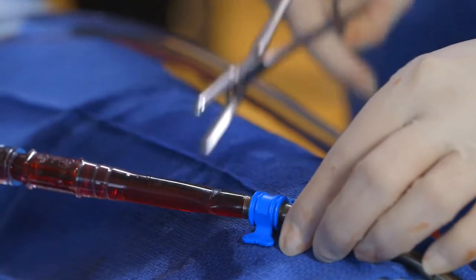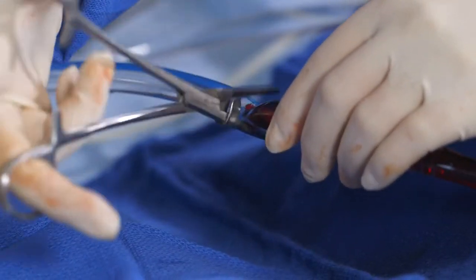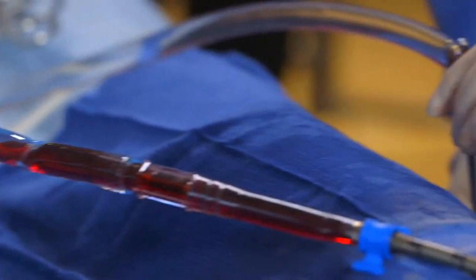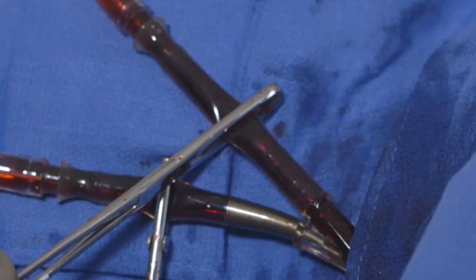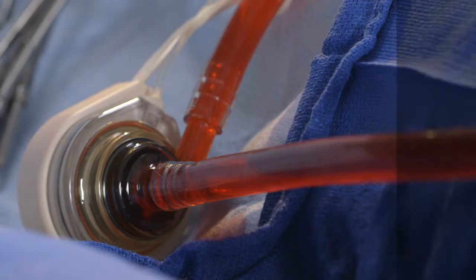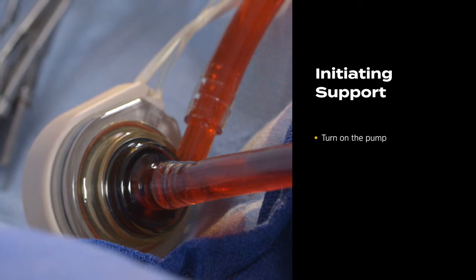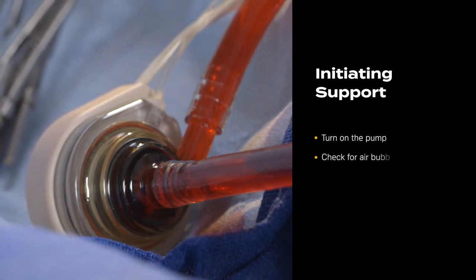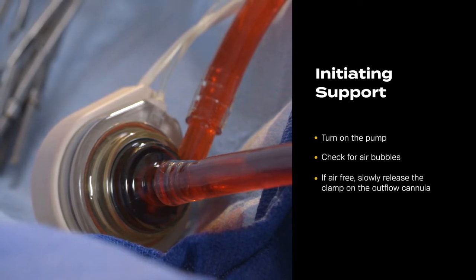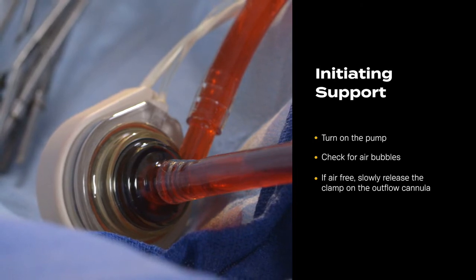Release the clamps on the inflow cannula. Release the clamps on the pump inflow tubing, marked with the blue stripe, and on the pump outflow tubing, marked with the red stripe. Do not release the clamp on the outflow cannula. Turn on the pump, which will start at 5,500 RPMs. If the tubing and pump are air-free, slowly release the clamp on the outflow cannula.